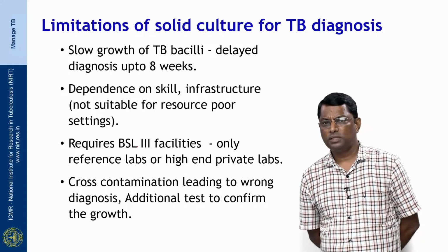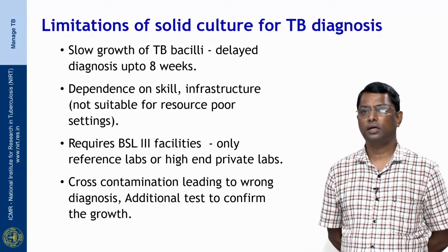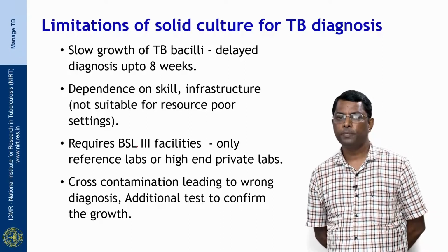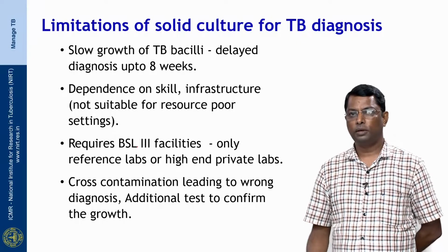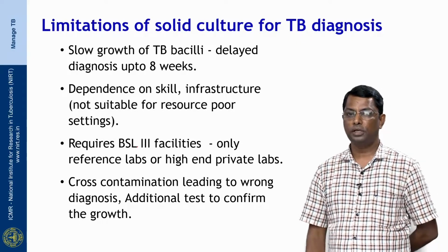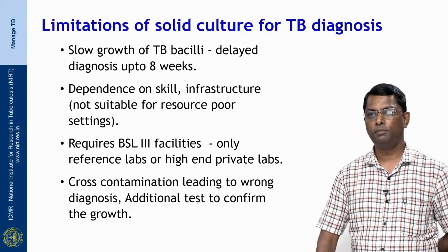Now, apart from this, cross contamination leading to wrong diagnosis is a remote possibility. Now, apart from the growth seen on the LJ medium, we need to do additional tests to confirm the growth to be Mycobacterium tuberculosis.